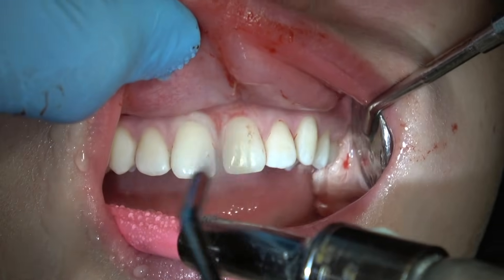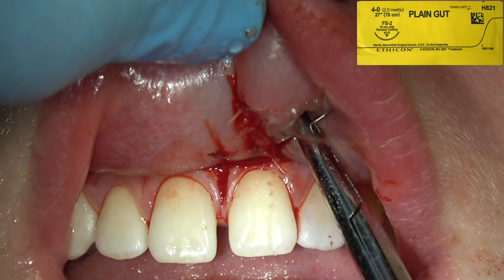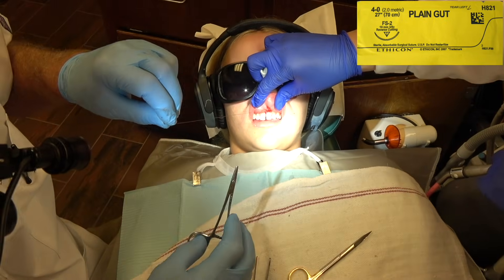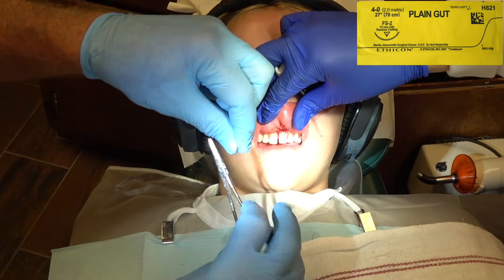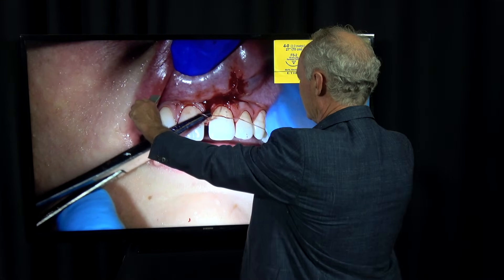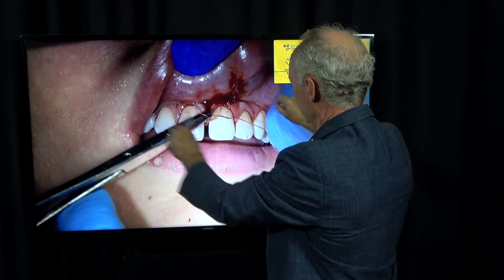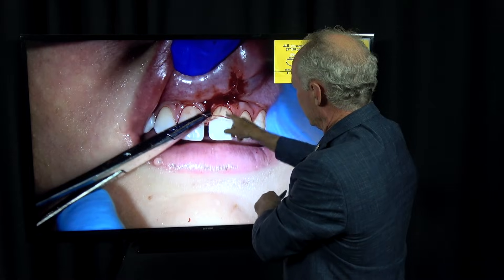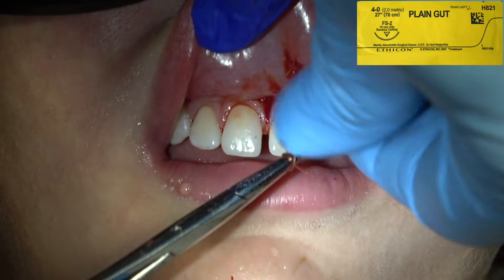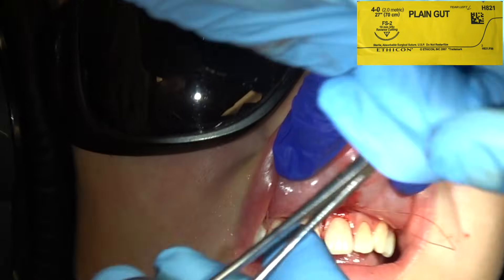You want to suture tight so the patient doesn't have bleeding post-operatively. When you pull this, there's one way you pull and this part is flat on the incision. There's another way you pull and it's bunched up — you want that to be flat. Pull one towards you, then one away. Pull those tight. This suture will dissolve in four to seven days.